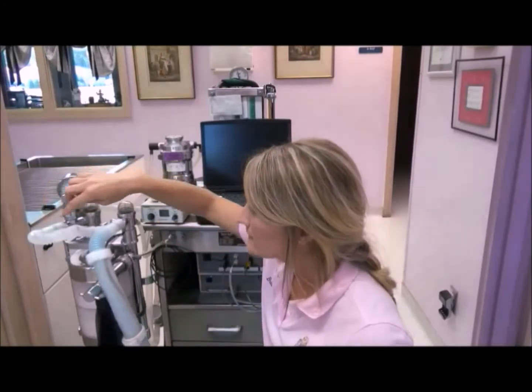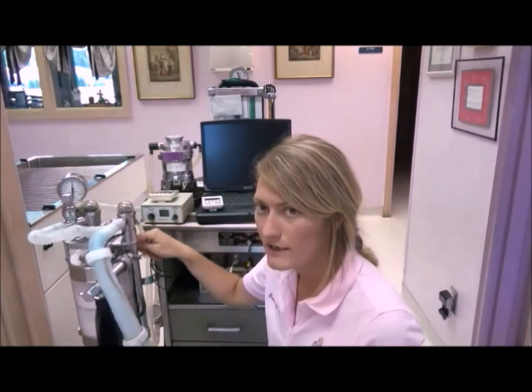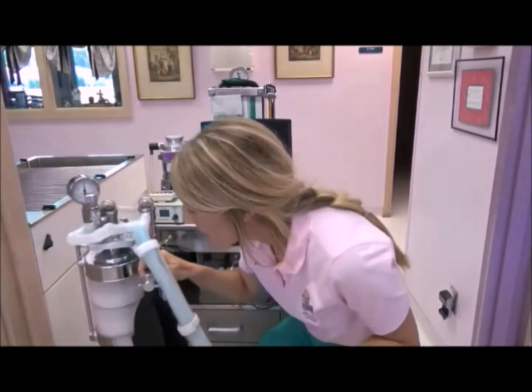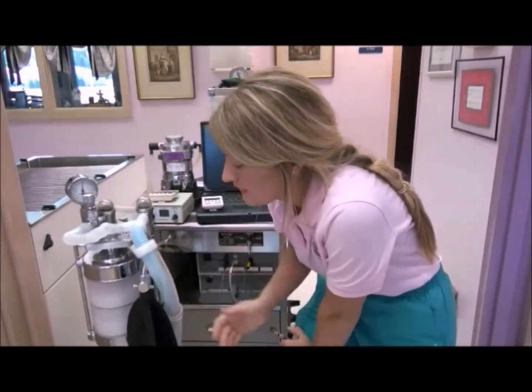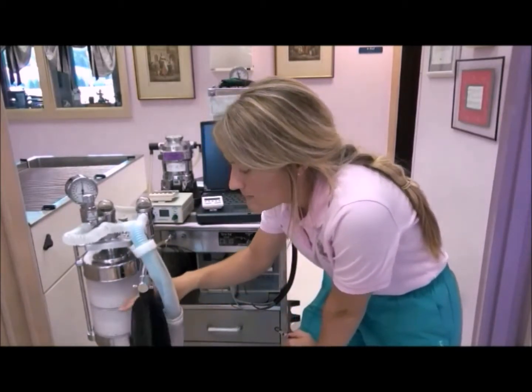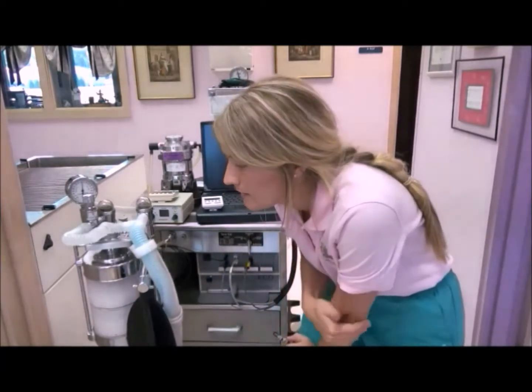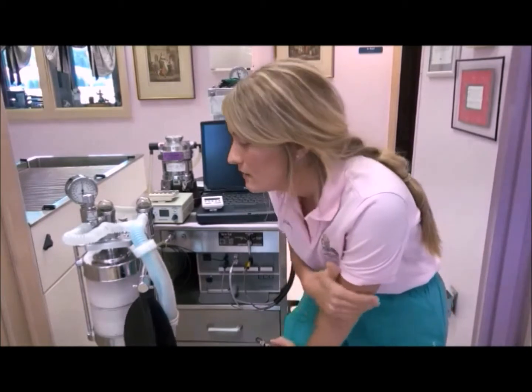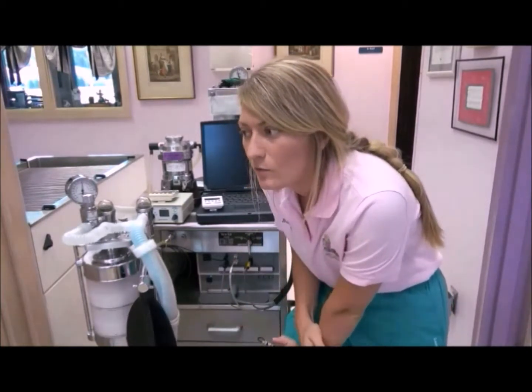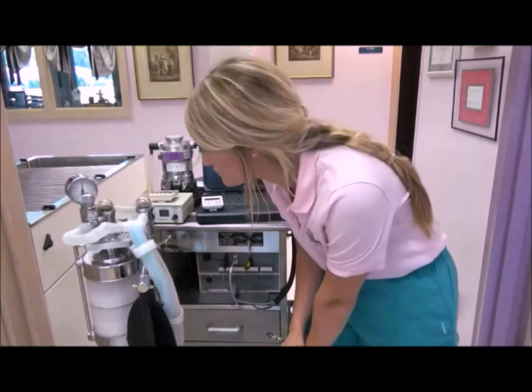From that point, the gas then travels to the CO2 canister. And this works by absorbing the carbon dioxide expelled in the animal's breath. So once the CO2 granules have been used up, it turns a purple color. I know the purple color does go away shortly after the anesthetic procedure is stopped. So we routinely change it every 30 days, if not sooner.